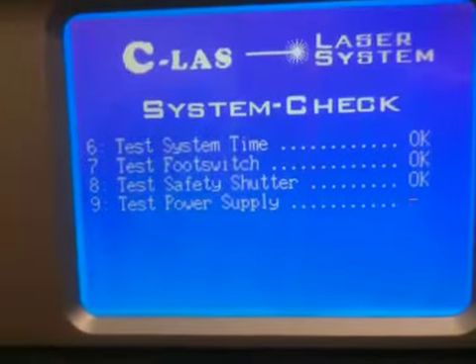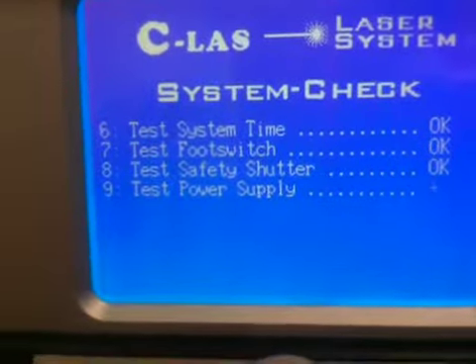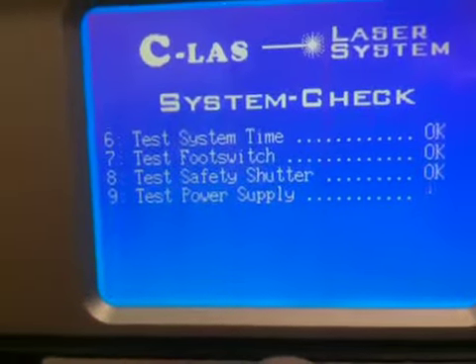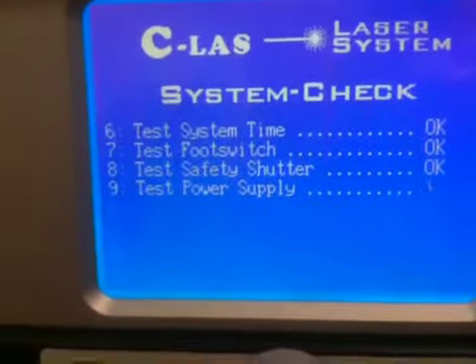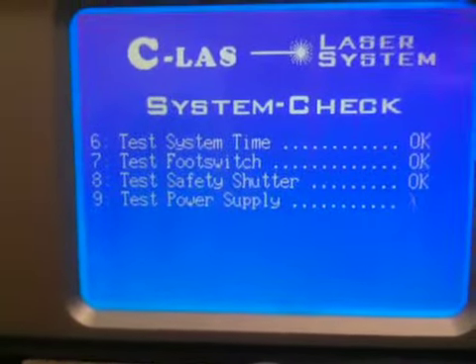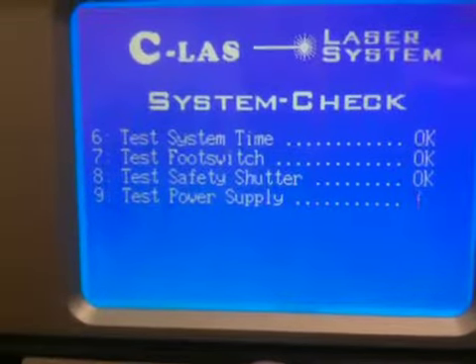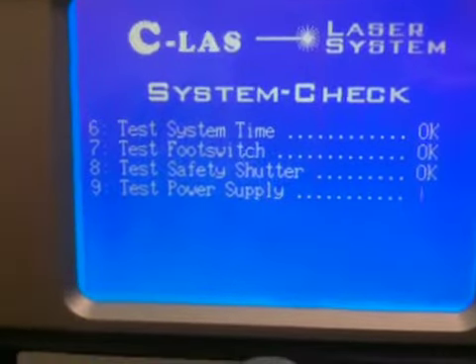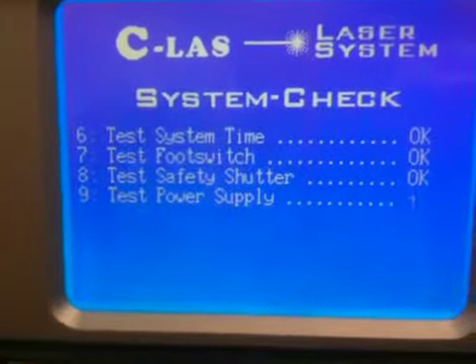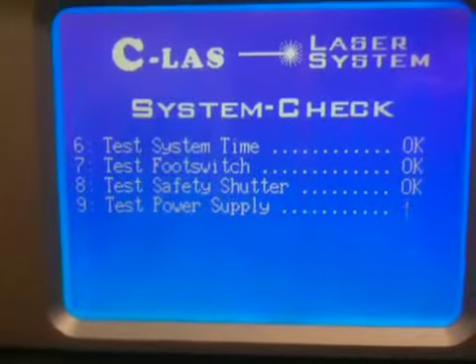So this simulates what they would do in a hospital, what they would see when they start the laser. Okay, so we want that to be somewhat of a predictable setting. The 1 watt CW or whatever it is, we want it to be very predictable, and we don't want it to be the 999 milliseconds that we have with version 1.5.